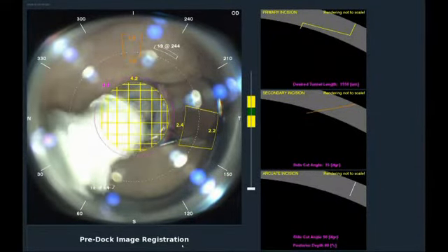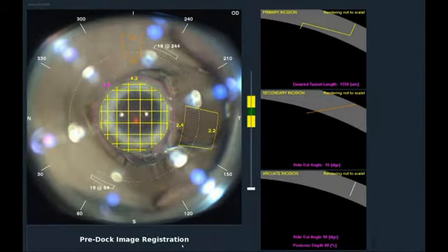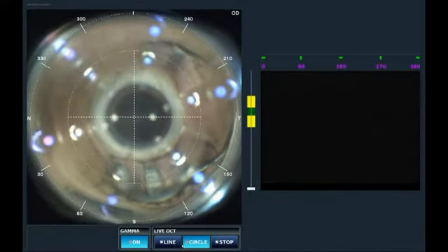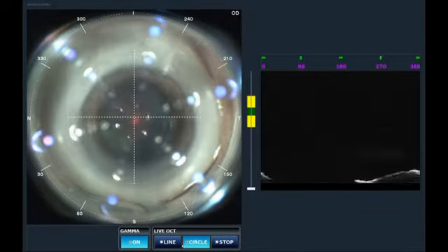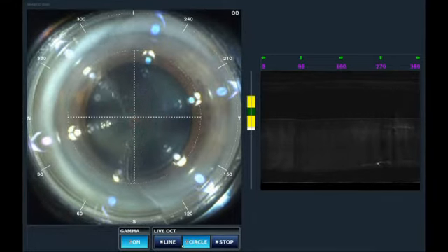Once again I'm going to want you to look at that little red flashing light. Just stare right at that red light — very good. Just stay right there. Excellent — suction.